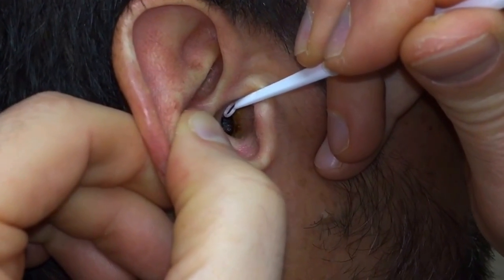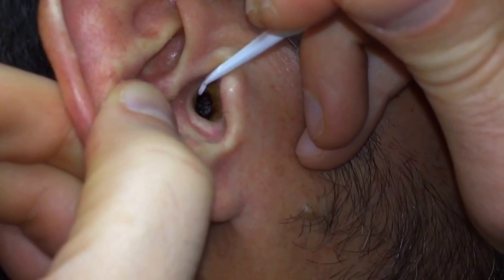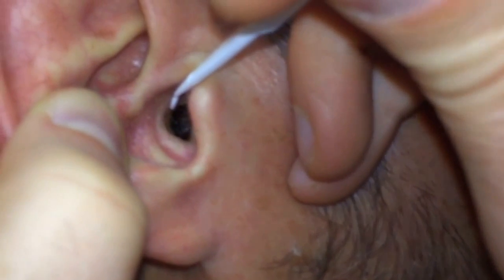Beautiful. Come a little bit to the right. There you go. Even more. So you can look straight in the canal.